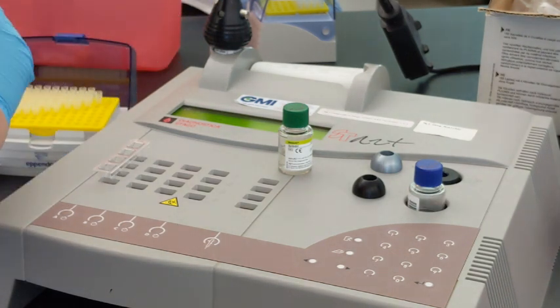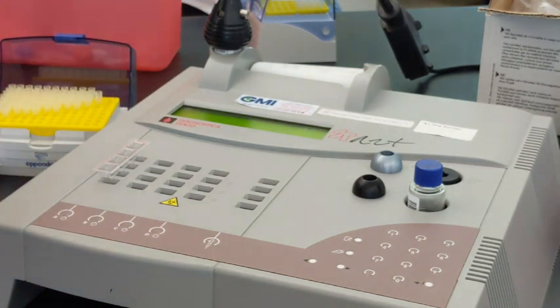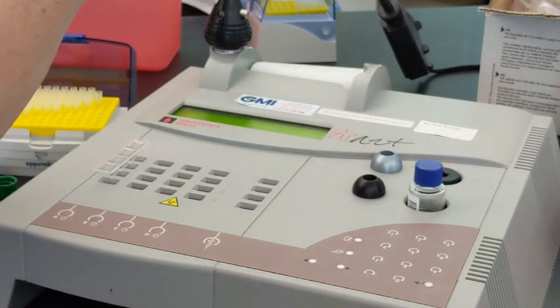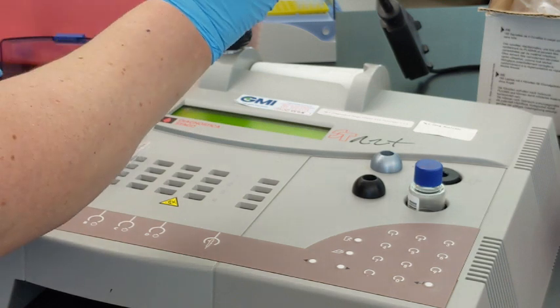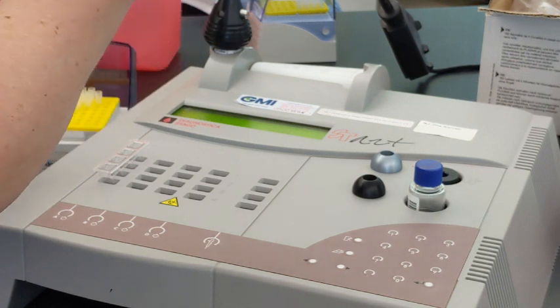So now what is required is that we are going to go ahead and add the reagent. So this partial thromboplastin reagent, we're going to go ahead and add 50 microliters. Always double check that you have the right pipette and the right volumes. I've seen students not have the right metric system of volumes or grab the wrong pipette. So go ahead and put this reagent in each of the wells.